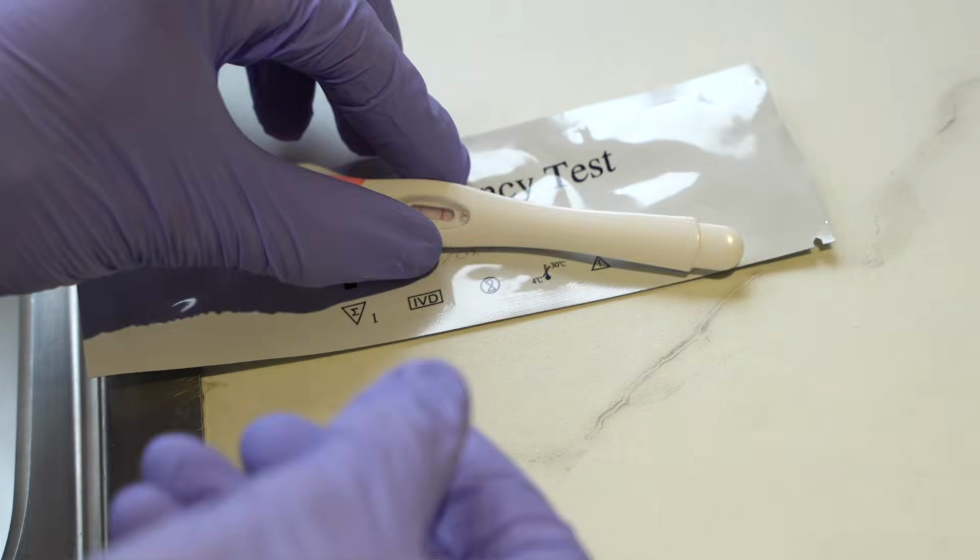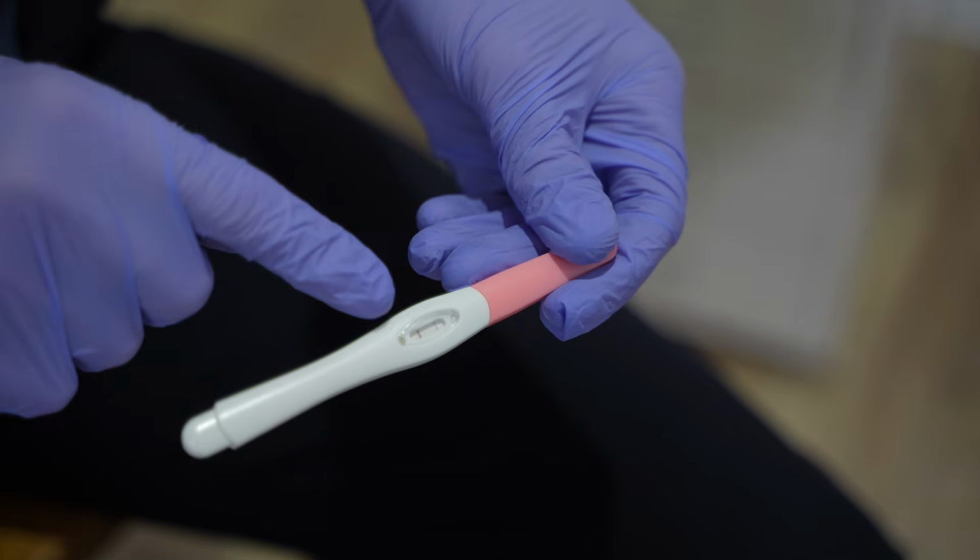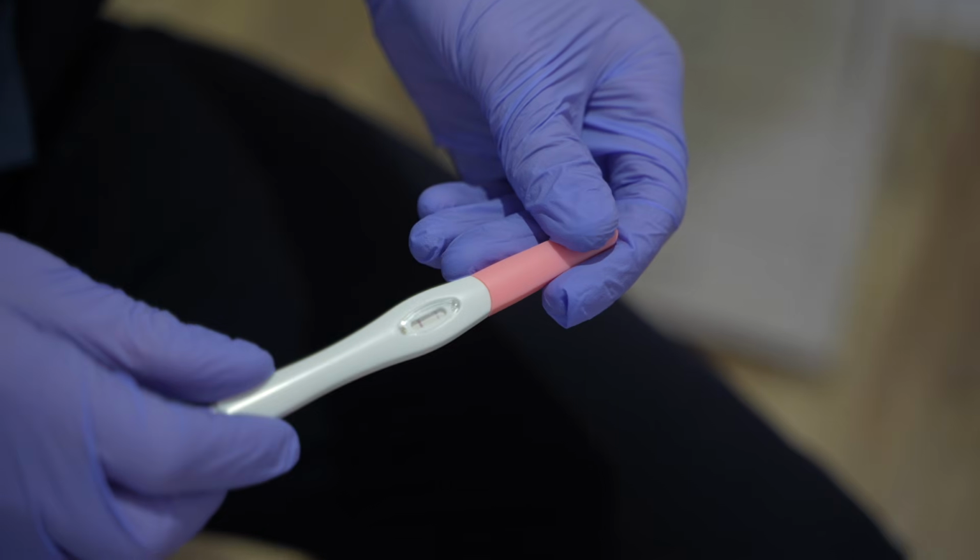I would always recommend taking the positive pregnancy test back to the patient so they can see that positive test result, because sometimes it's a thing that a patient would want to double check and see those results for themselves, and sometimes people would want to be able to take it away as well. In all cases, I would always advise the patient that they can repeat the test themselves if they've got any doubt.